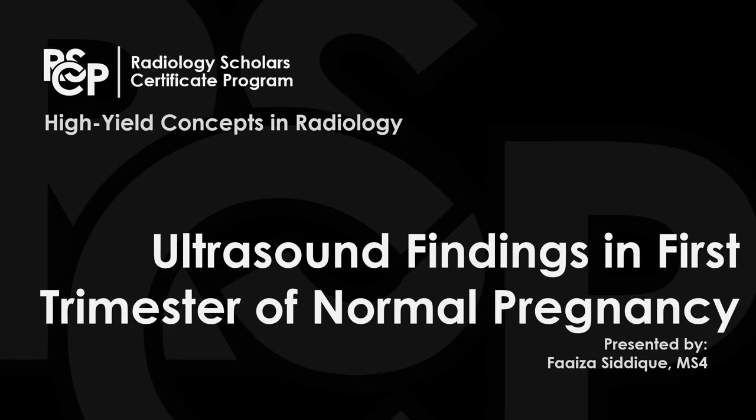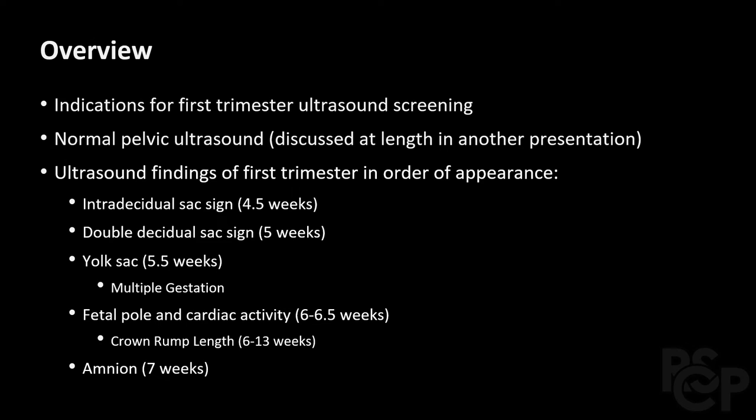Welcome to a presentation on the ultrasound findings in the first trimester of a normal pregnancy. In this presentation, we will discuss the indications for first trimester ultrasound screening. Normal female pelvic ultrasound was covered in another presentation, so if you have any questions, please check that out. We will go through the ultrasound findings of the first trimester in order of appearance and speak of them each in detail.